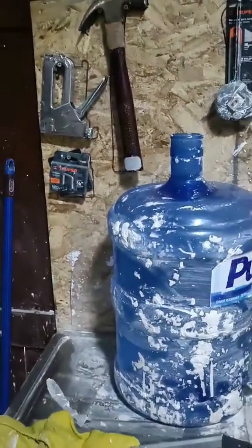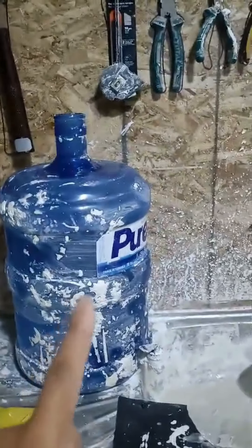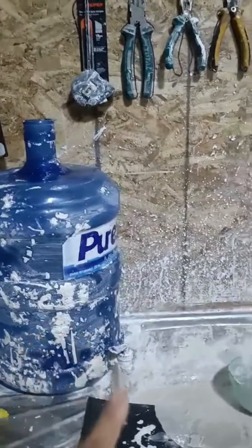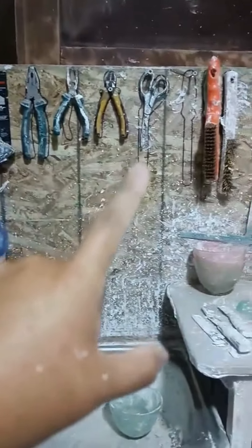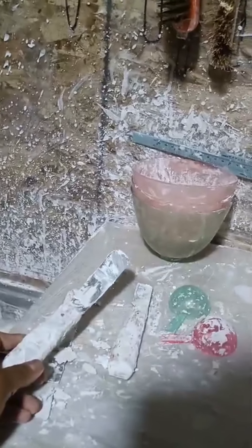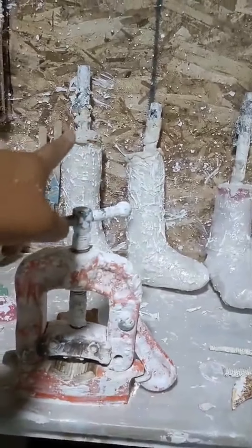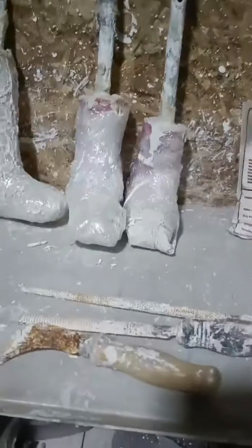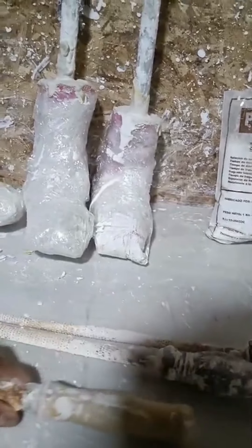Hi, these are the tools that I use to make the cast. This is where I get the water. All of those are the tools that I usually use. This tool is to mix the powder of the cast. This is where the tubes go when I'm shaping the cast. These are the tools that I use to shape the cast.